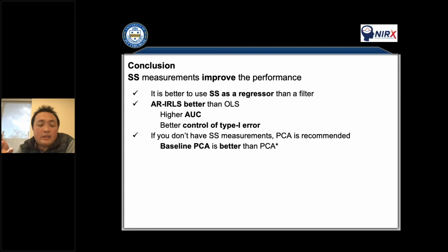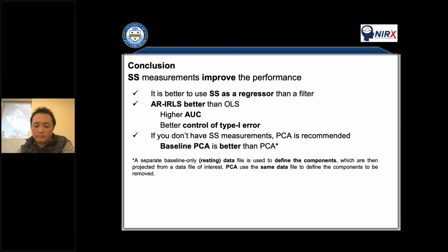You can ask the subject to do nothing for 5 minutes and then use that information to get the first couple of components, and then use that for your task or for the signal. But if you don't have the baseline resting state data, for example for a kids population, you can still use PCA if you want.